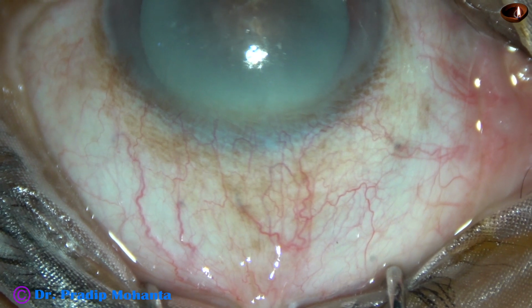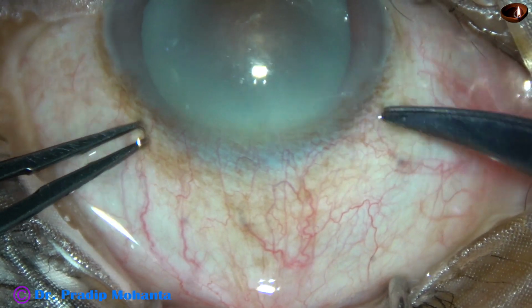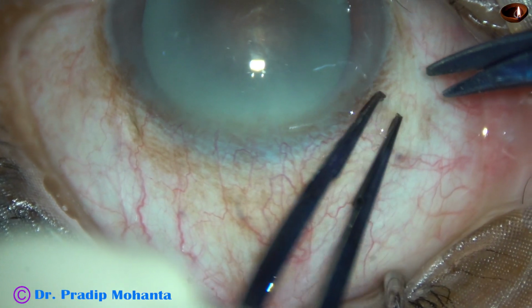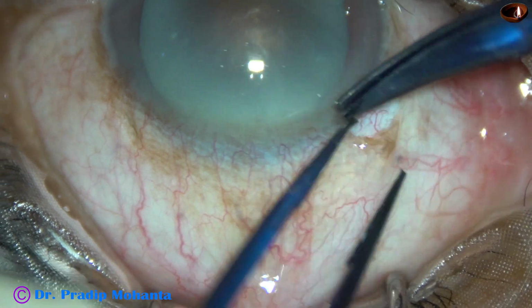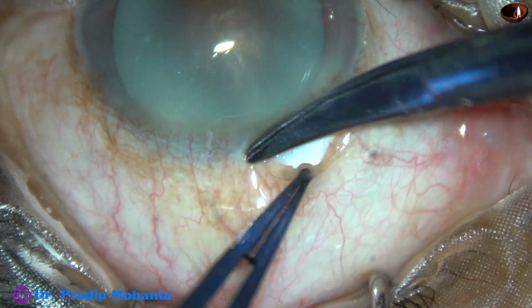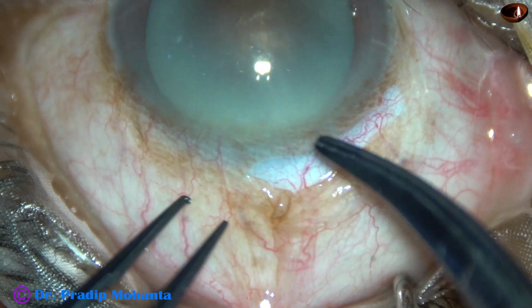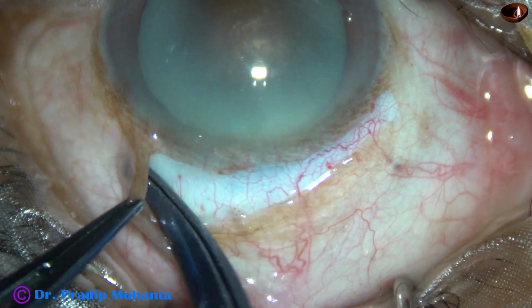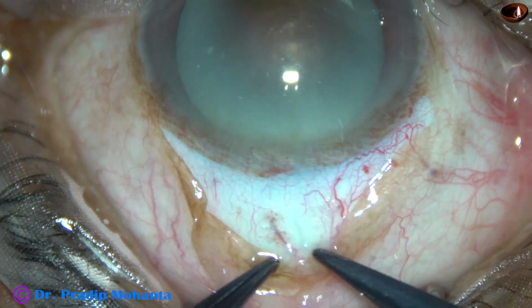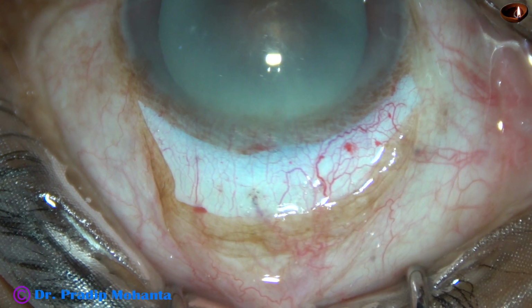This is a large incision cataract surgery. I call it double SICS because two SICS wounds are placed adjacent to each other, and then only one suture is placed at the joining point of the two SICS wounds. Let us observe this surgery.